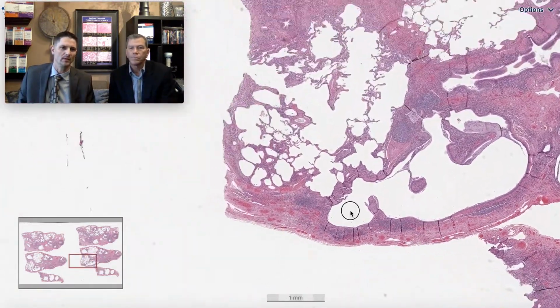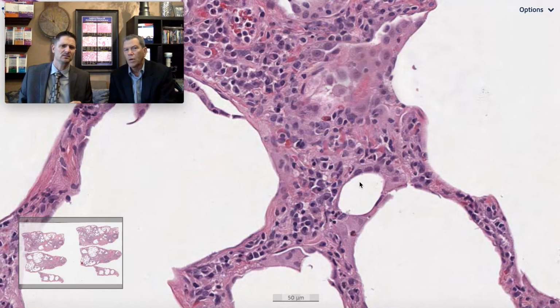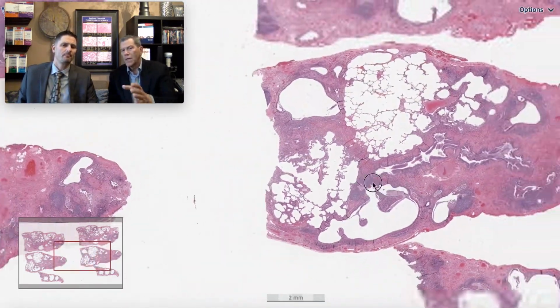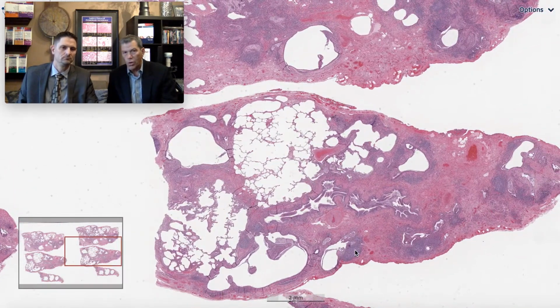Yeah. So in this case, so far, we've identified lymphoplasmacytic cellular interstitial infiltrates, almost looking a little NSIP-like in some areas. We've identified secondary follicles. Right. There's a little bit of chronic bronchiolitis. And all of that is superimposed on what is a basic UIP pattern of fibrosis. Right. So is this helpful? If we establish in our diagnosis that this is most likely related to an autoimmune disorder, systemic autoimmune disorder, and rheumatoid arthritis would lead our differential, if the clinician says, well, I was hoping we'd get an IPF diagnosis because we have a therapy for that.